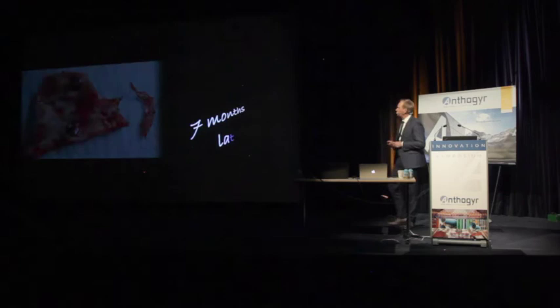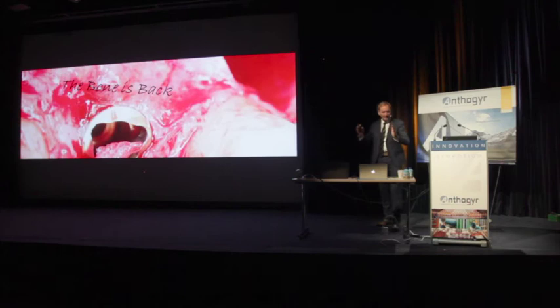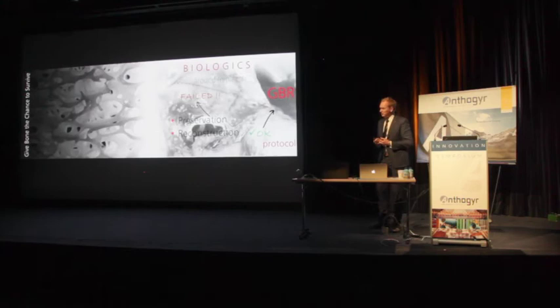So a lot of work, but luckily 7 months later, you see, I'm removing the membrane. My bone is back and it stayed in front of the implant because of the bone tacks fixating the membrane. So we can do a lot of work. The preservation strategy: the first implant failed, reconstruction was okay. The GBR was very successful, as you can see. The new implant is in place.